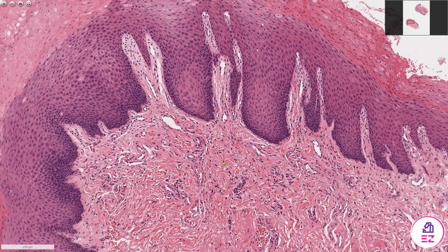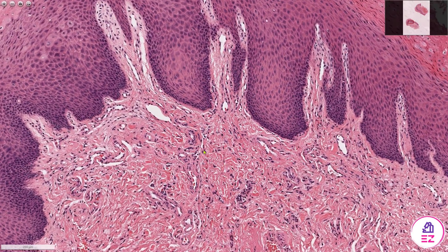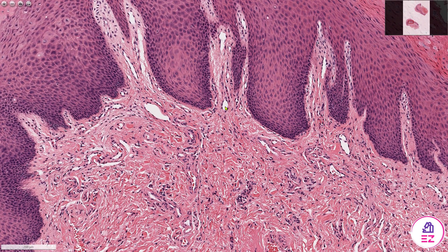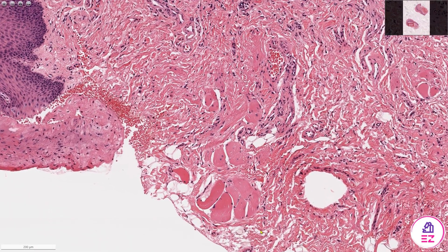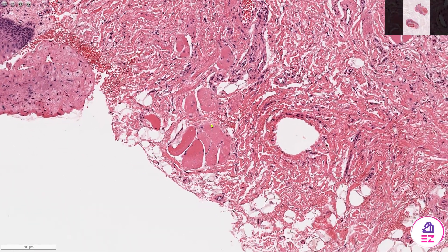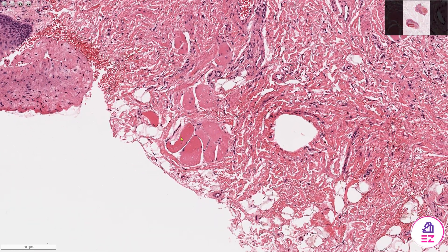Beneath that, in the lamina propria, I can identify several capillaries, but largely the connective tissue has a normal appearance and is uninflamed. And moving down into the submucosa, we can see bundles of striated muscle and also collections of adipocytes.